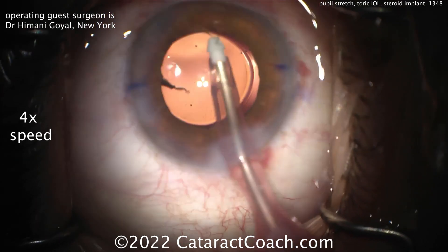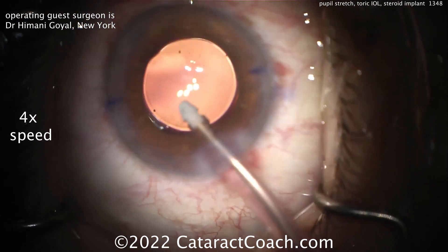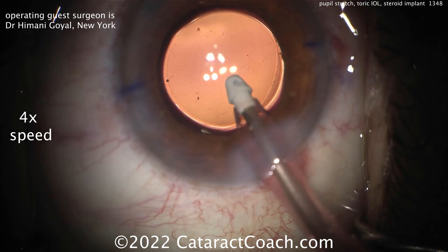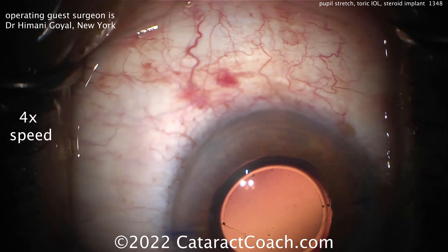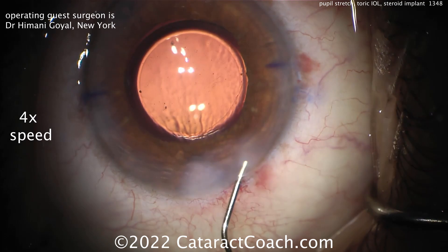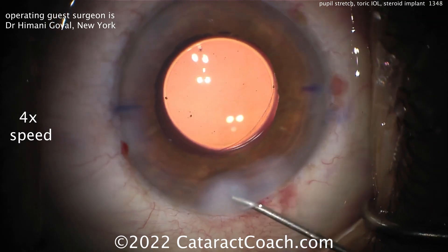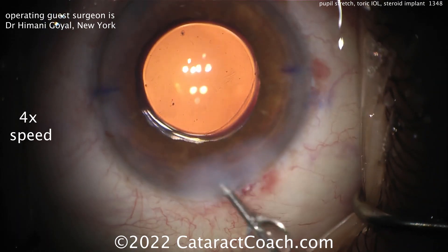I also wanted to show this case because Dr. Goyal uses a dexamethasone steroid implant. She's going to place that in the patient's inferior canaliculus. That steroid implant is temporary — it'll release steroid through the canaliculus, up to the punctum and to the ocular surface, and should last the patient maybe a week or two in the post-op period. Sealing up the incision — that looks pretty good. Lens is lined up where she wants it — that looks fantastic.